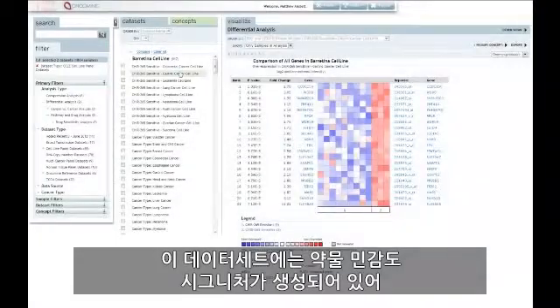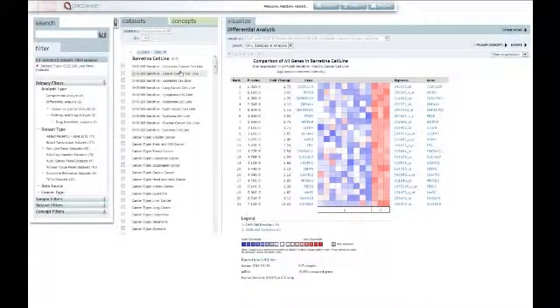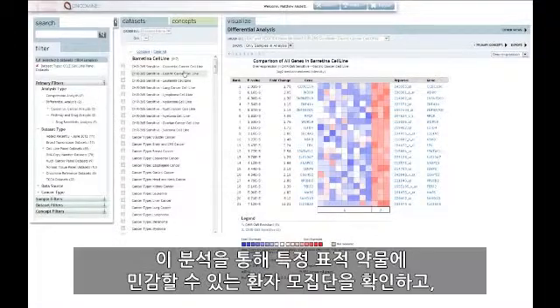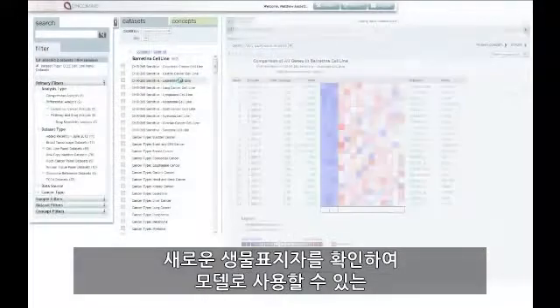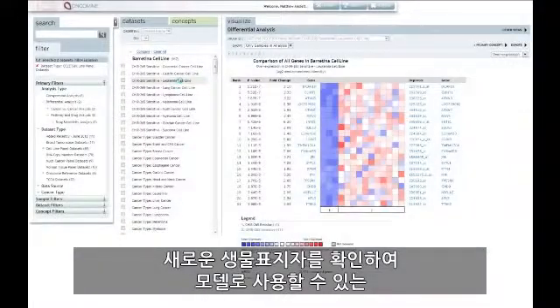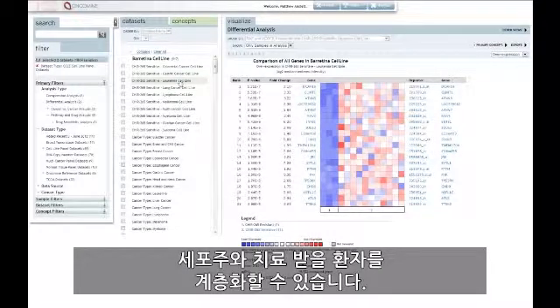From these datasets, drug sensitivity signatures were generated and are available in Oncomine for hundreds of drugs. These analyses can be used to identify patient populations that may be sensitive to a particular targeted drug, identify novel biomarkers to stratify patients for treatment, and cell lines that can be used as models.